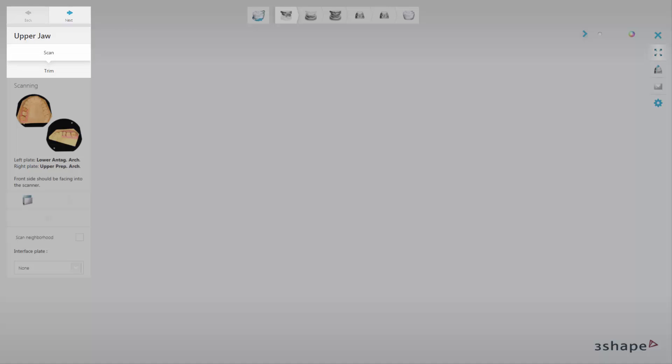Each of the workflow steps contains a number of sub-steps, guiding you through the scanning process. ScanIt Dental also has a section which provides graphical information about the current step and guides you through the scanning steps in a simple and fast way.